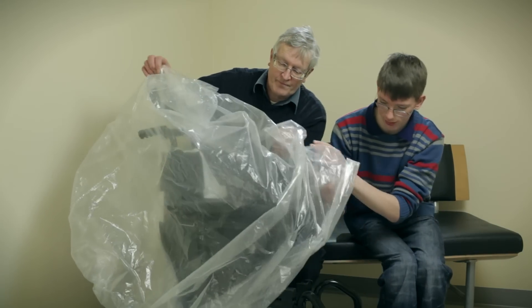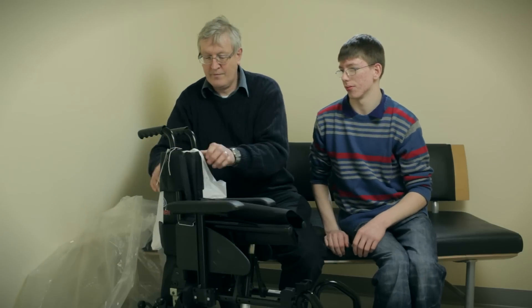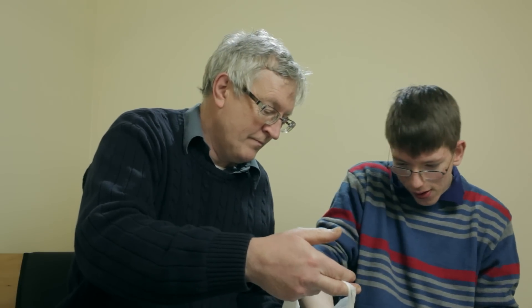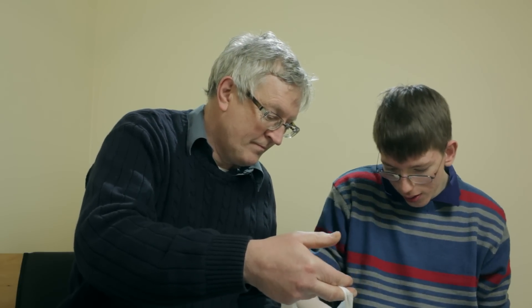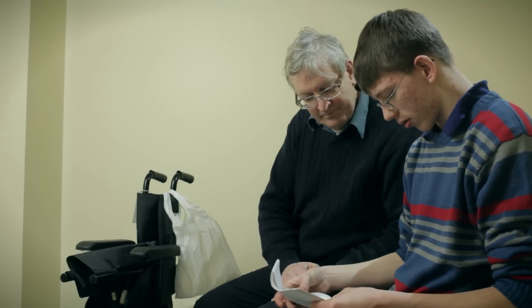When you get the chair, it might be packed in plastic. If it is, remove all the packaging and be careful not to lose any parts or instructions. What you see in this video should be used in conjunction with the leaflets that you were given with the chair. You need to read all those leaflets before using the chair for the first time.